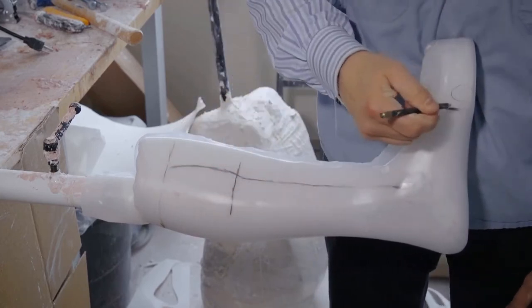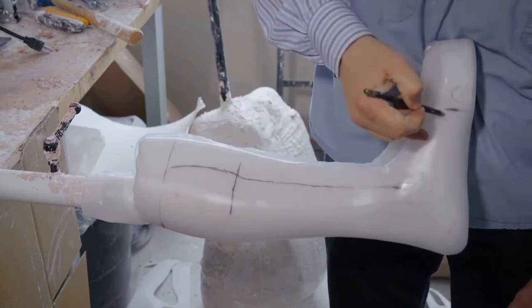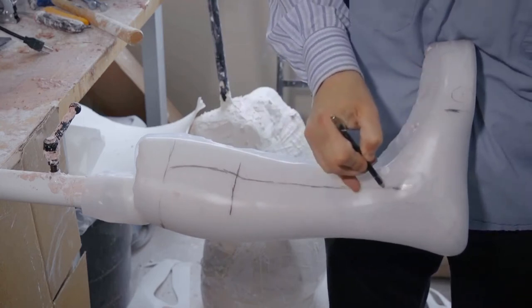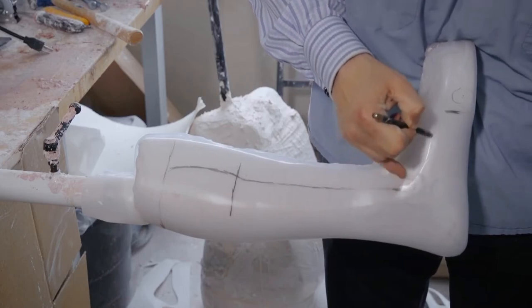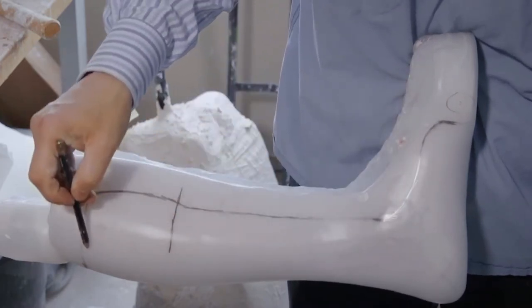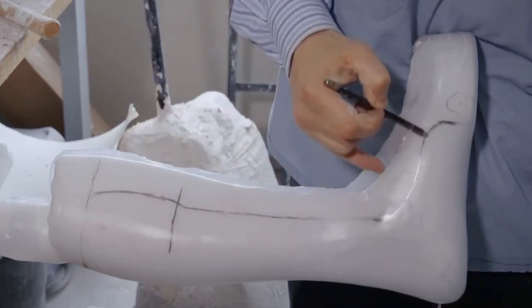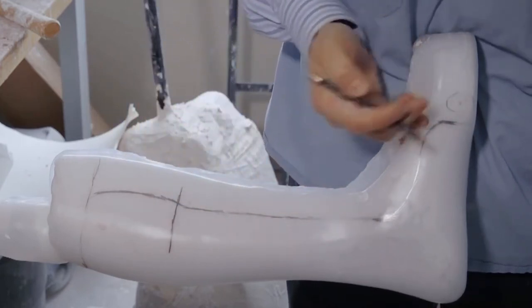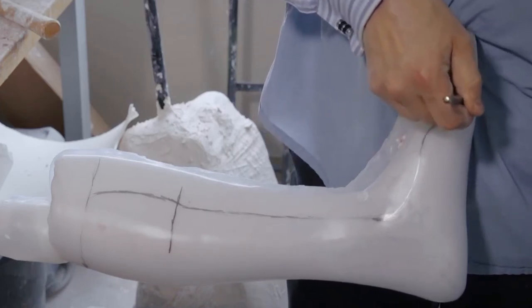An orthotist doesn't want to rub right on that joint. No one's going to like that. So we stay behind that, and now we start connecting our lines here. So this would be how the solid ankle AFO turns more into, now we're going into the foot portion. So we have our height, comes all the way down here, stays behind the first metatarsal phalangeal joint in most cases, and now we have our foot plate.